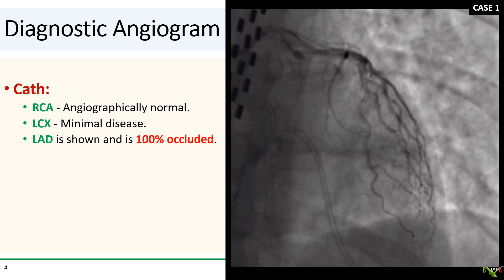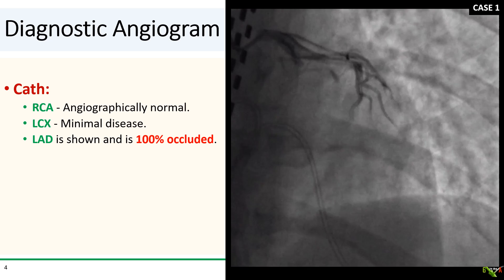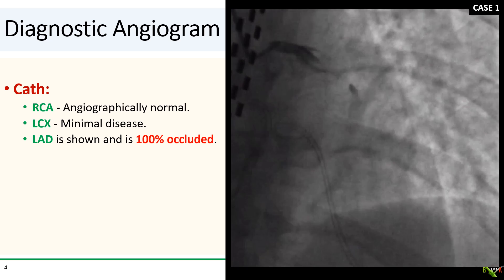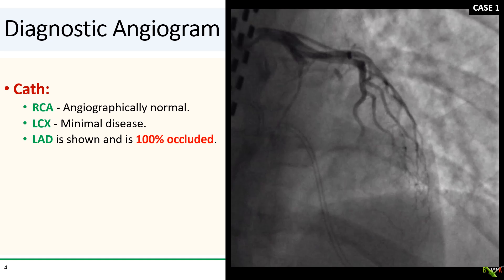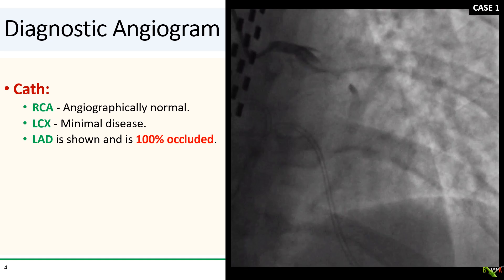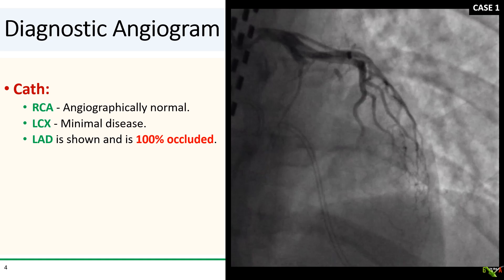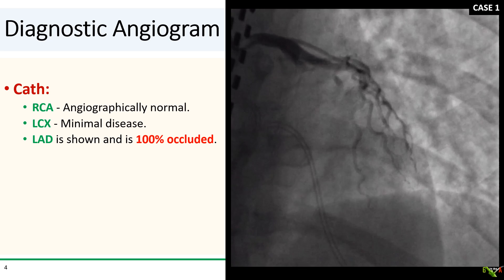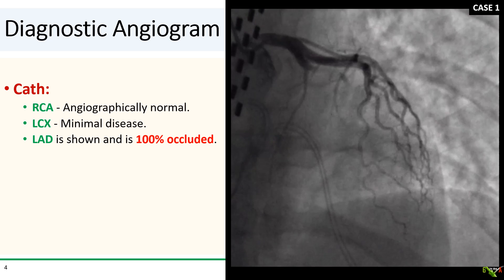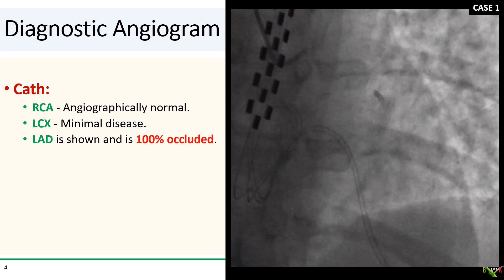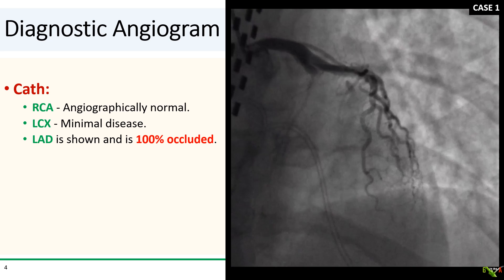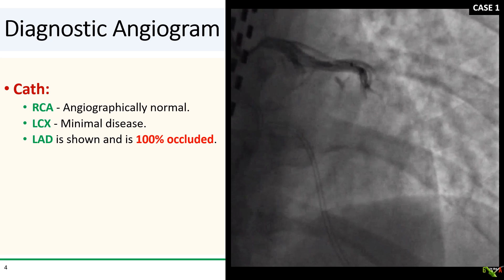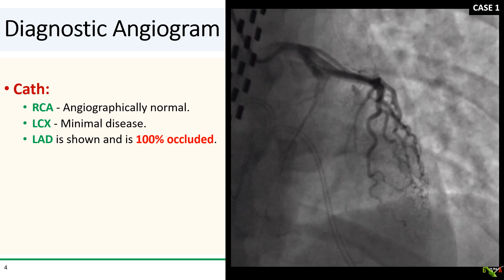On cath, the RCA and circumflex were fine, but here's the LAD, and as you can see, it is 100% occluded proximally. There is also dye staining suggesting that this is an acute thrombotic occlusion — in other words, essentially a STEMI involving the proximal LAD. Boy, are you glad you took her to the lab quickly.